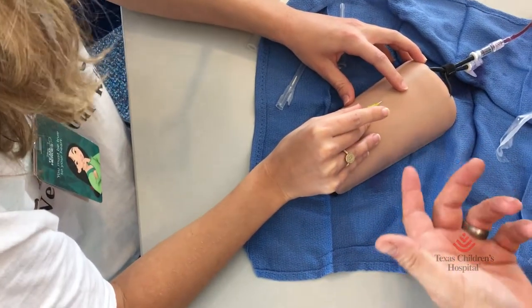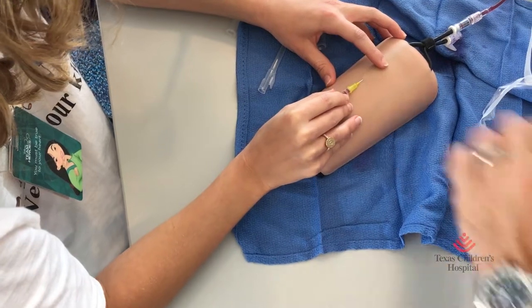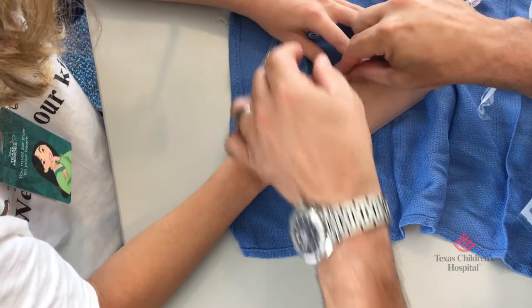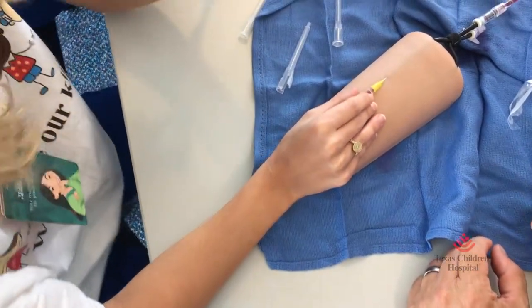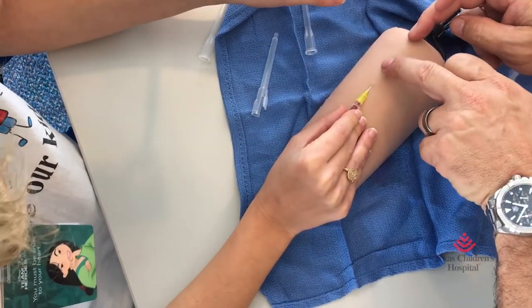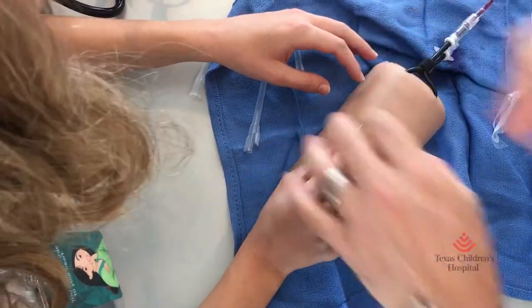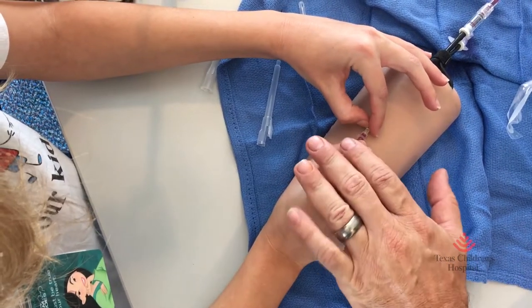At this point you can just rest and watch the blood flow back. Lower it to the patient's skin with this finger. Advance the catheter — these two are going to pinch like that and just go whoop. Can you describe that again? This is where I always struggle. I am holding this steady because the metal is guiding that catheter into the vein. These two fingers are coming up like this and it's pushing that in — the yellow part.